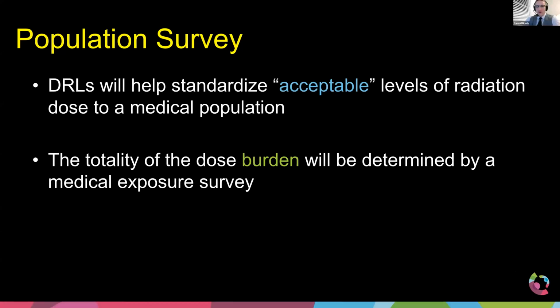When we talk about radiation dose, remember the big picture here: we're talking about diagnostic reference levels, and how we use them to optimize dose. We send off all that data, and Dr. Panru Tai and her team have established Thai national DRLs. Now those numbers come back to the hospital, and we use them in our optimization team to make an informed decision on what we do.